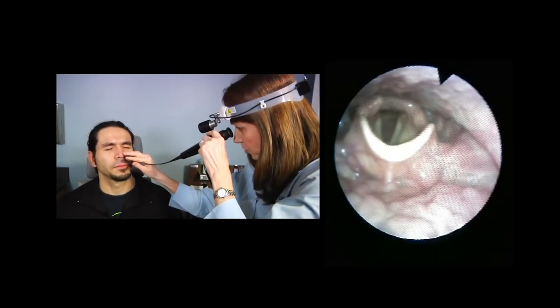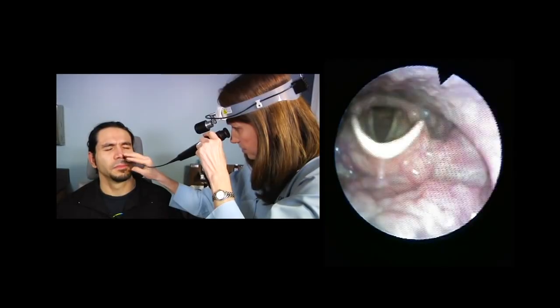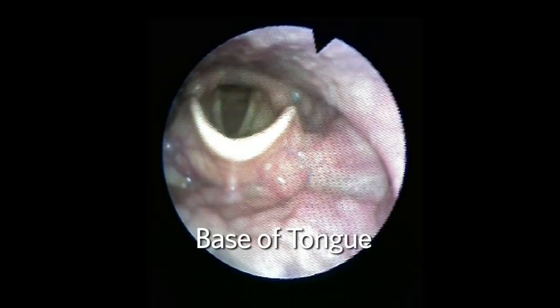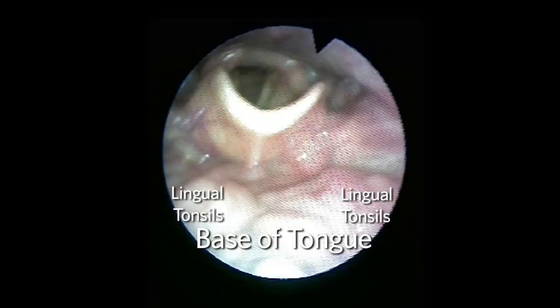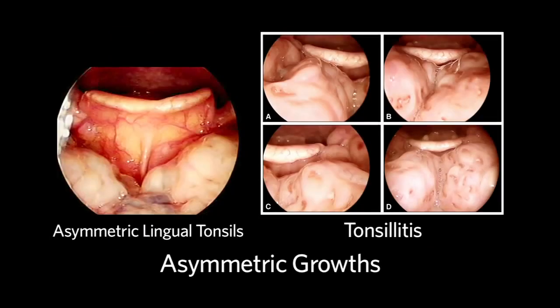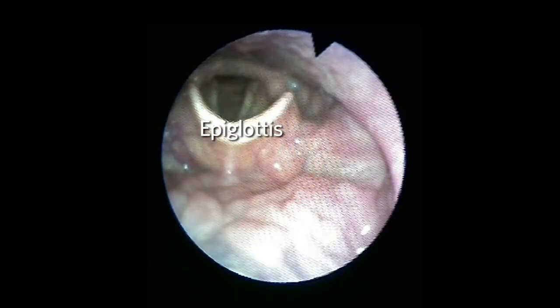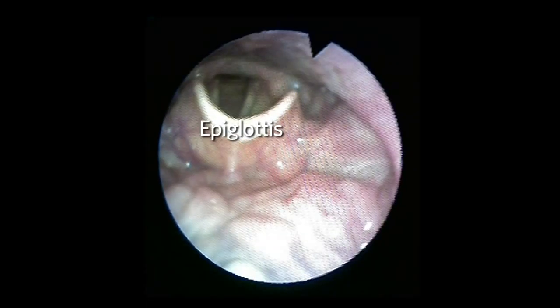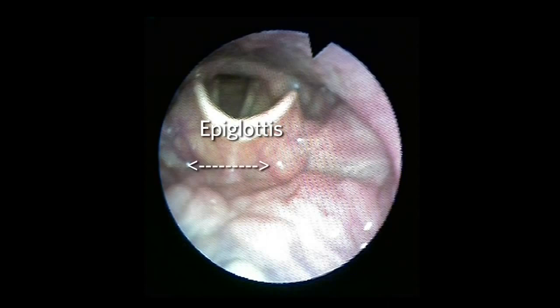We're through the nose and I'm looking at your larynx. The base of tongue with the lingual tonsils are noted, just anterior to the larynx. It's important to look for masses or asymmetric growths, which can originate in the lingual tonsils. The epiglottis is seen posterior to the tongue base. The space between the anterior aspect of the epiglottis and the base of tongue is known as the vallecula.